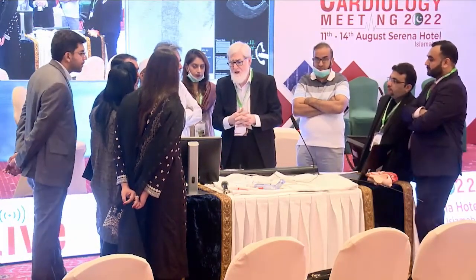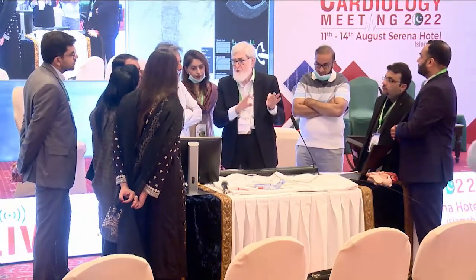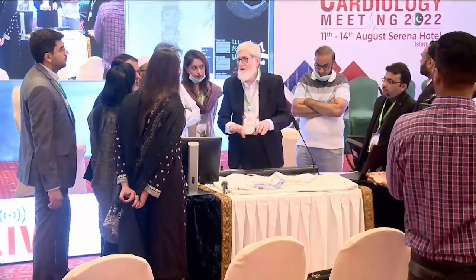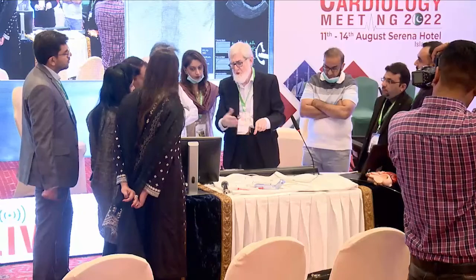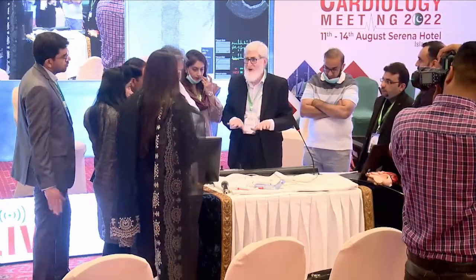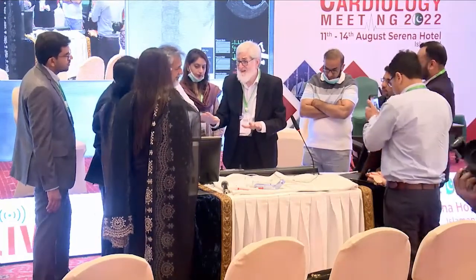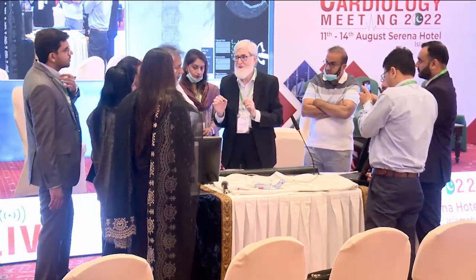Okay, so you reach the SVC. Then you follow with the Mullins sheath and the dilator. Yes. So let's go. Because this thing, like you, I am also seeing it for the first time, so maybe I may not be that apt in this. I just want to feel it.